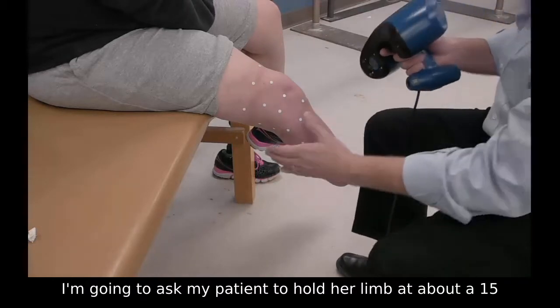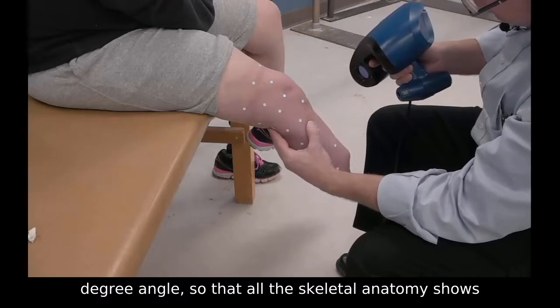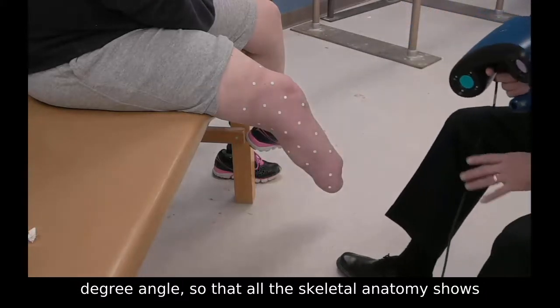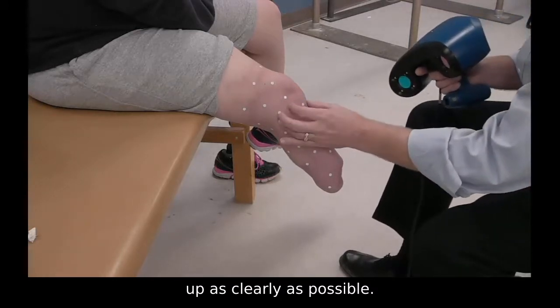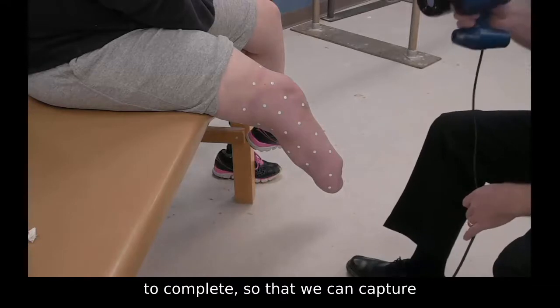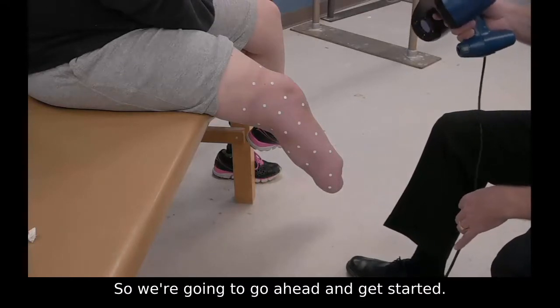I'm going to ask my patient to hold her limb in about a 15-degree angle so that all the skeletal anatomy shows up as clearly as possible. And this should take somewhere between 4 and 7 minutes to complete so that we can capture the entire residual limb. So we're going to go ahead and get started.